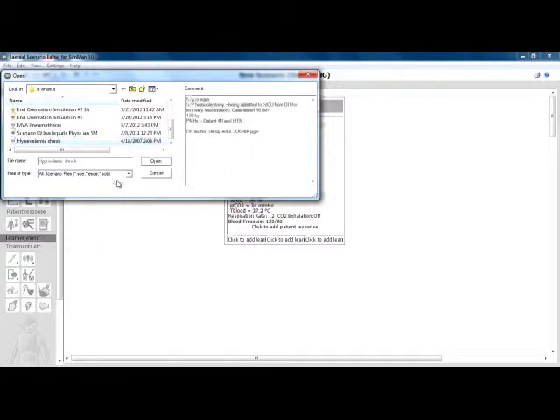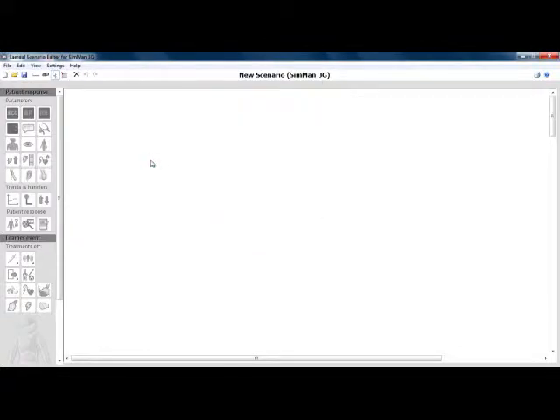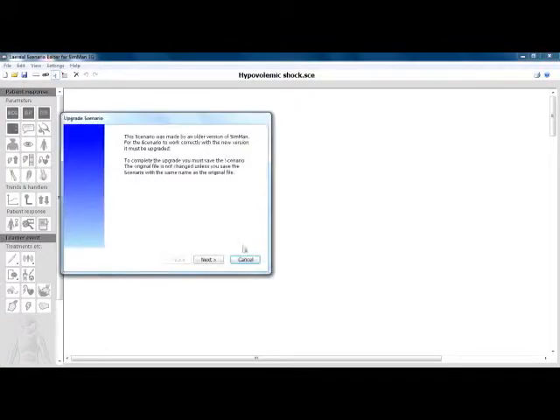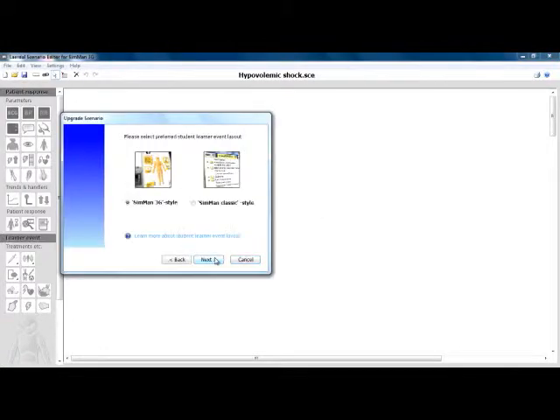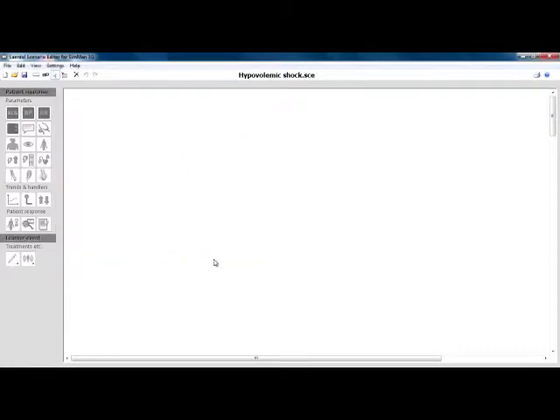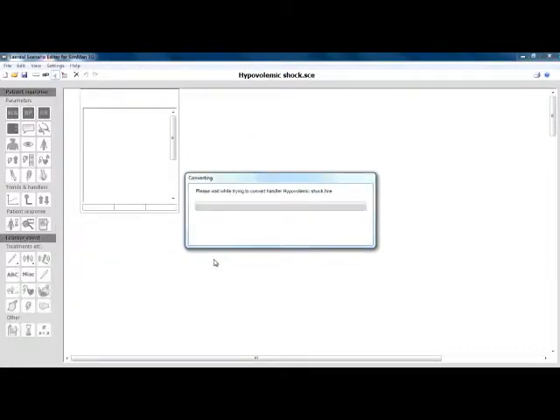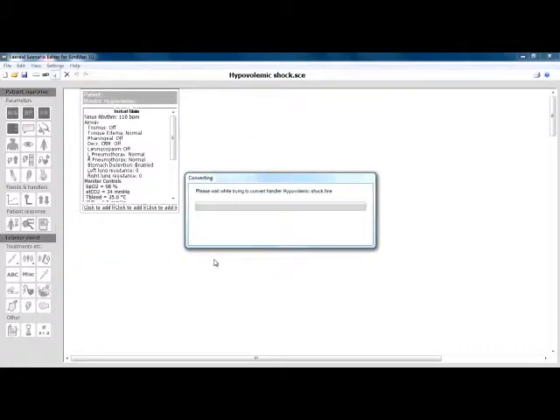The upgrade window will appear. Select next, then select SimMan classic style and next, then select finish. You will be asked to wait while the scenario is automatically converted.